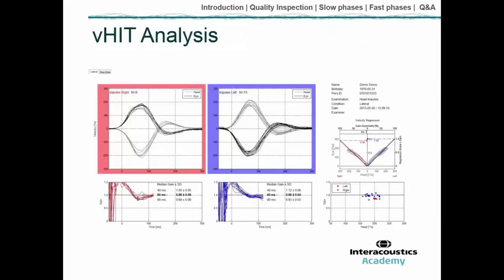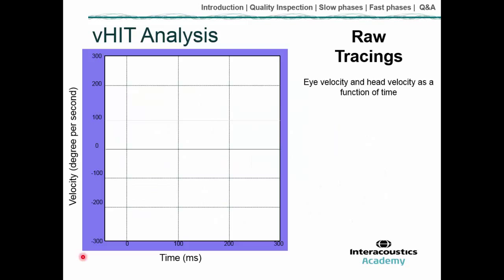Once you've completed the examination, you'll get a report displaying several graphs. At first you may feel daunted, but the results are very concise and easy to understand. The first graphs show raw tracings recorded with the video head impulse test, displaying velocity as a function of time, comparing eye velocity and head velocity.